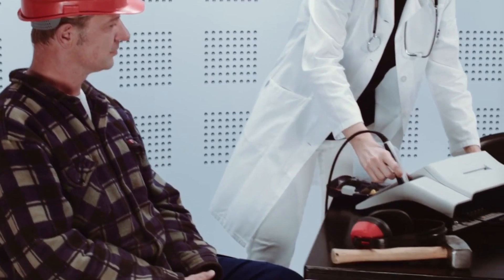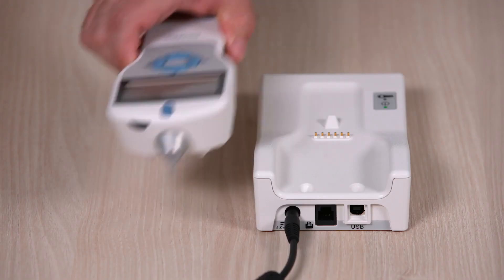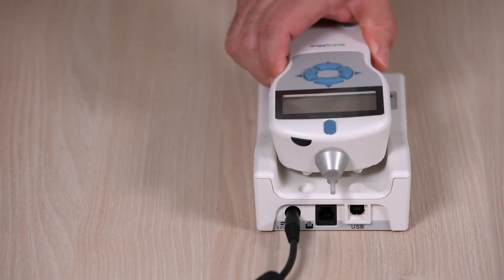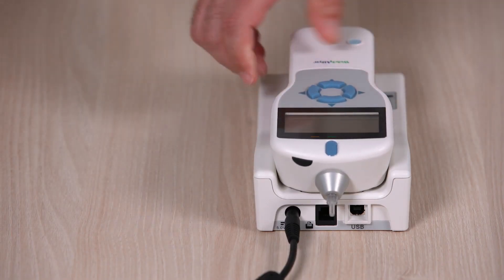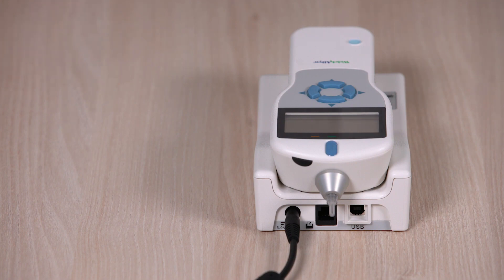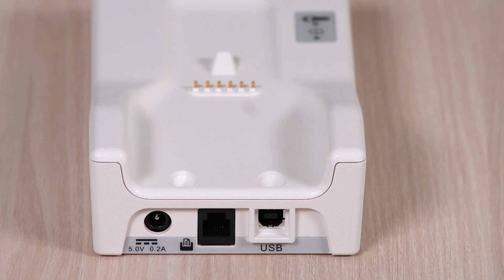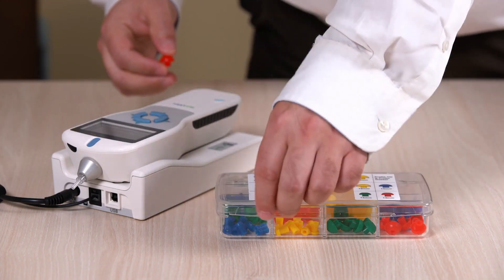Now let's look into tympanometry. A tympanometry test detects problems such as fluid or wax buildup, perforated eardrums, ossicle bone damage, or tumors in the middle ear. Acoustic reflex testing evaluates the cranial nerves and brain stem.